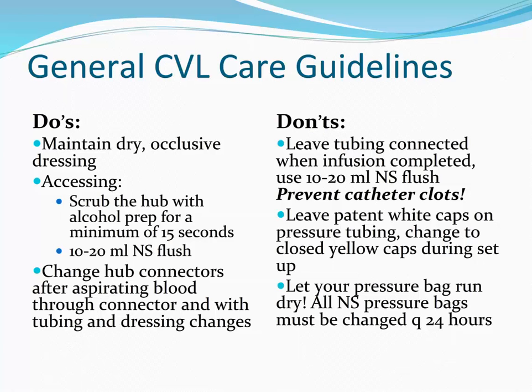Please do not leave tubing connected to your CVL if it's not infusing. This can result in clotting, dampened waveform, inaccurate CVP readings, and loss of access. Also, do not leave the white caps on your pressure tubing. These caps are intended for setup only. They allow you to flush the tubing while maintaining sterility at each open site. They're vented caps and must be replaced with closed yellow caps when tubing is all primed.